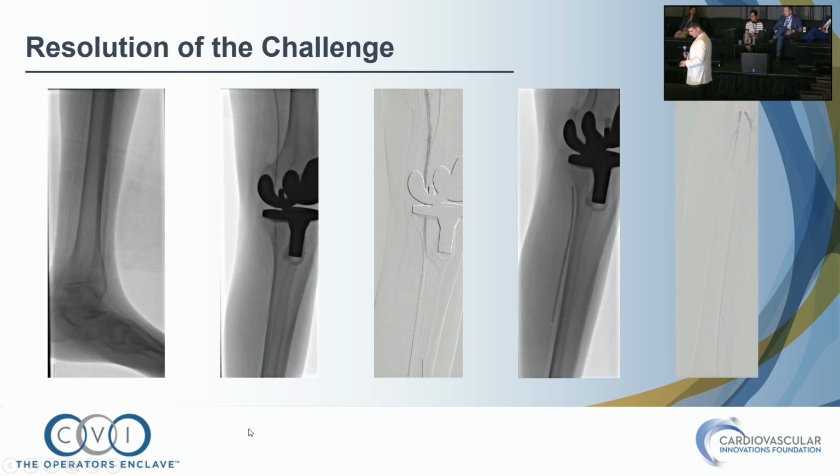Okay, here you have some flow. Now we can see some flow from the popliteal into the AT, but I think there's still thrombus in the TPT. So we ballooned that TPT, PT, and on the right side panel, you can see the flow is better, but you have significant residual clot in the TPT, and I think it's causing critical narrowing. I think close to 90%.